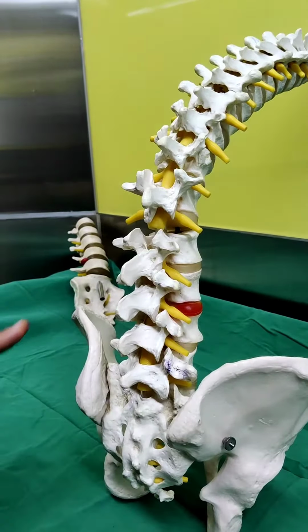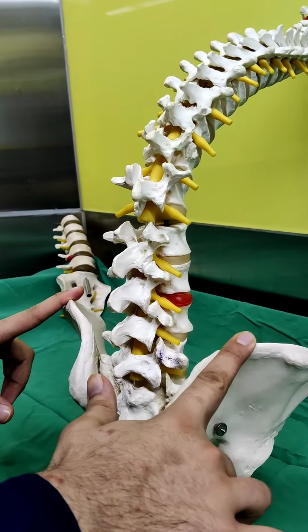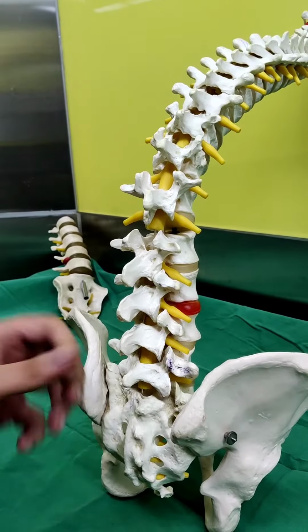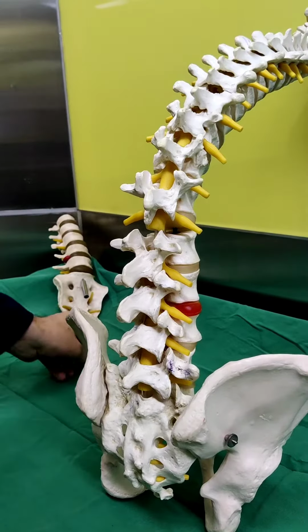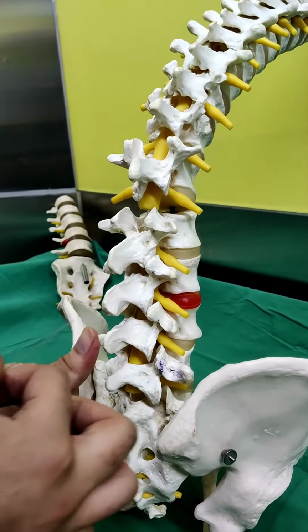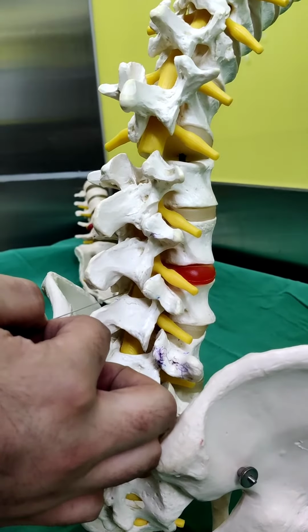So once we have given a proper position to the patient, we usually palpate the highest point of the iliac crest and palpate the corresponding spine, which usually corresponds to L4, L5, and it's known as the Tuffier's line. So once we have palpated the space, we go in between the space and usually perform the subarachnoid block.